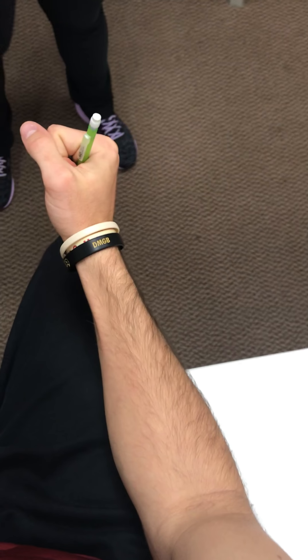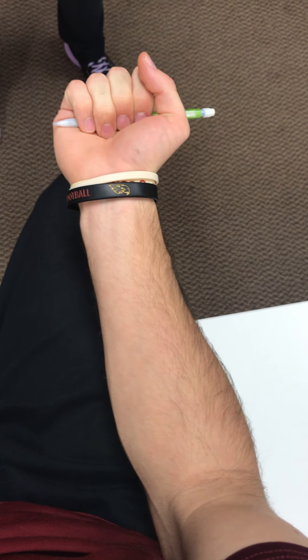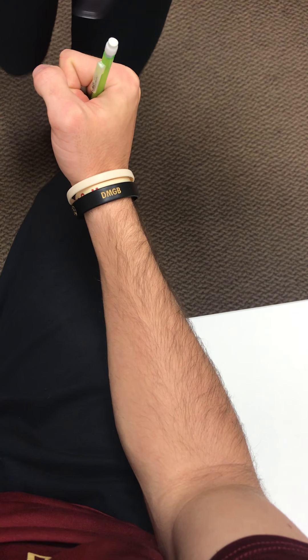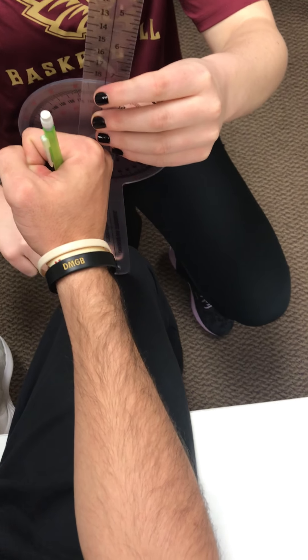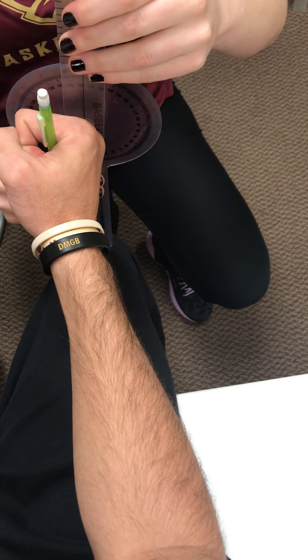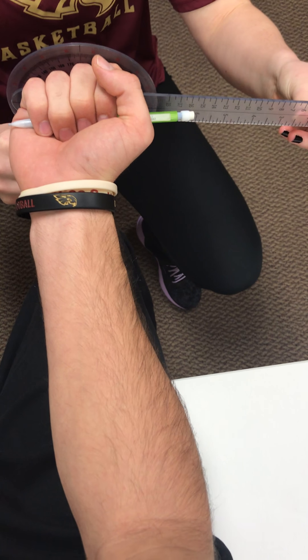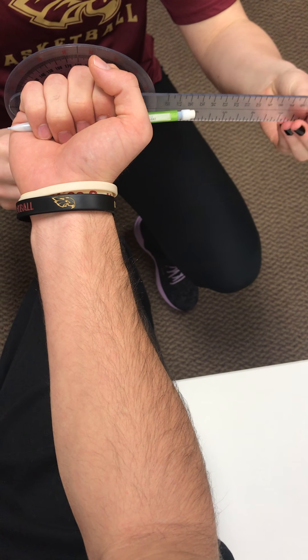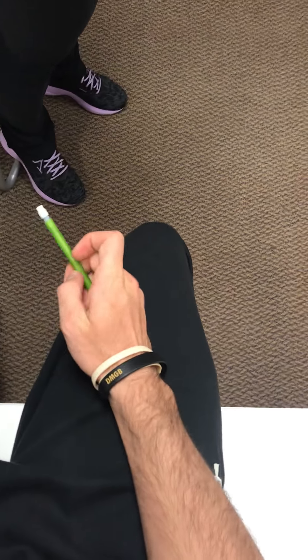Next, we're going to have supination, so if you can sit. We're going to have them hold something like a pencil, and if you could rotate your hand — like you're holding a bowl of soup. So now we're going to line up the fulcrum with the third metacarpal. The stationary arm is going to be perpendicular to the ground, and he's going to rotate his hand again. Now I'm lining up the movement arm with the second metacarpal. He's at 90 exactly, and he's supposed to be at 90.